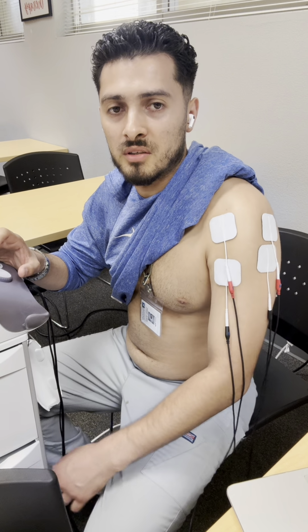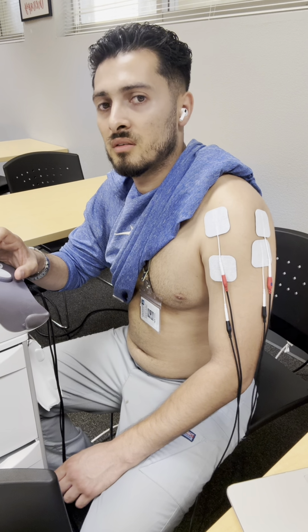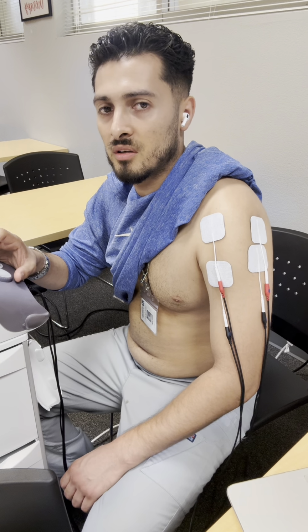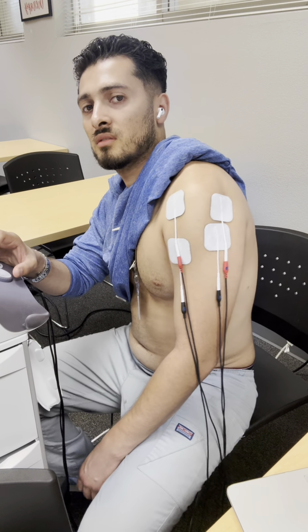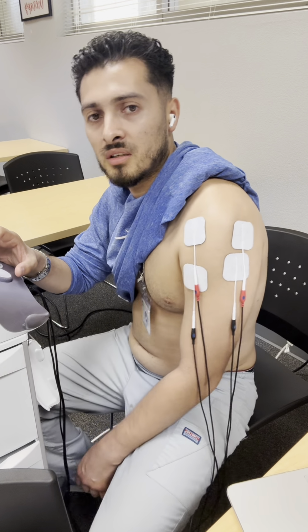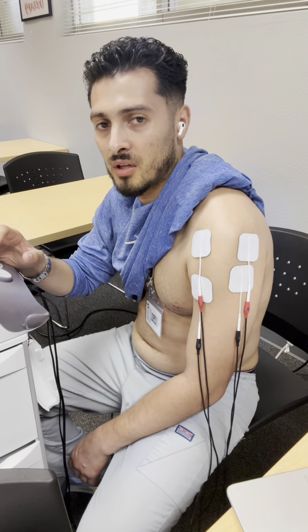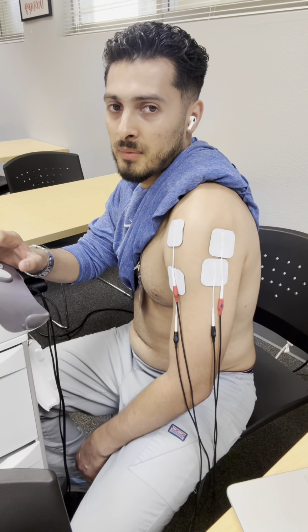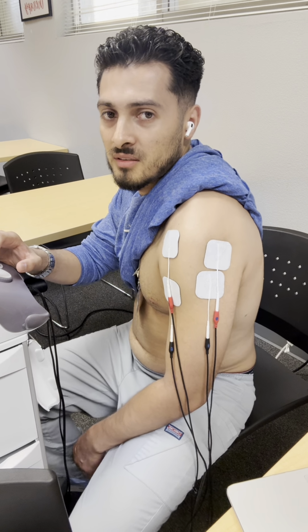Get some movement going on in there. And that one definitely triggers more muscular contractions. Posterior deltoid going crazy, which makes sense. I don't have the best posture, do a lot of slouching, and so that posterior part of my deltoid and my rotator cuff are pretty tense.